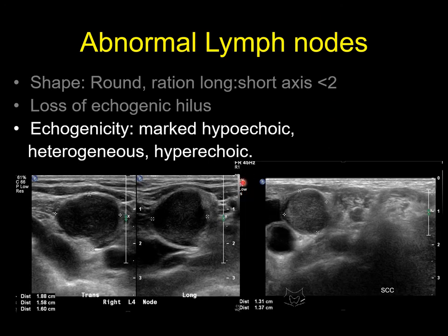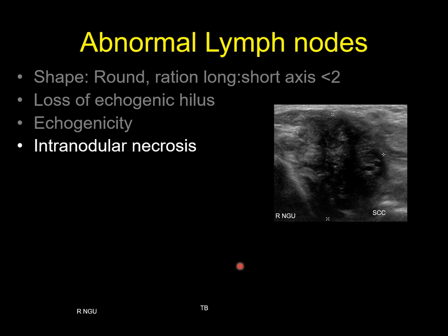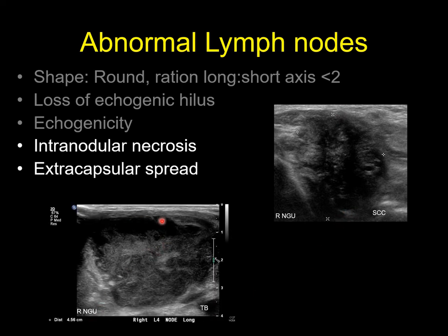Other signs of abnormal lymph nodes are that they tend to be markedly hypoechoic, they can be heterogeneous, or they could be hyperechoic, as you can see here. Other features of abnormal lymph nodes include intranodular necrosis, and here you can see the intranodular necrosis. If you look carefully, there is also extracapsular spread of the node.